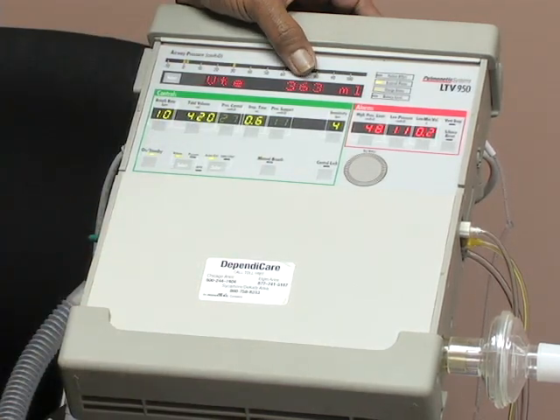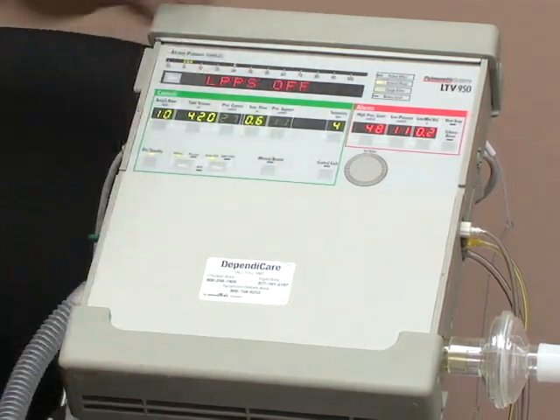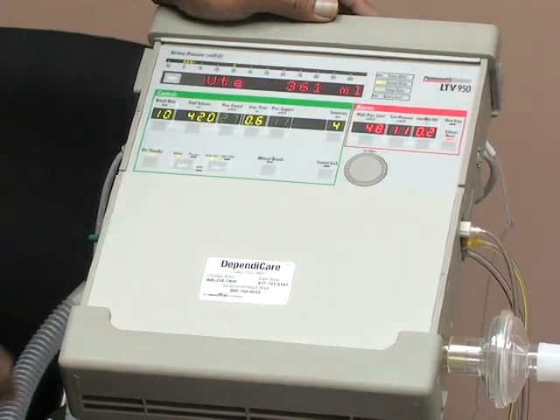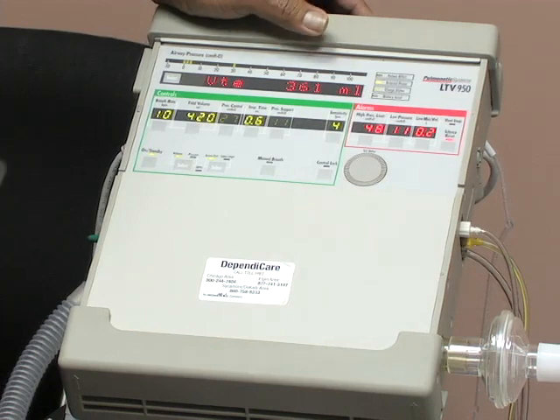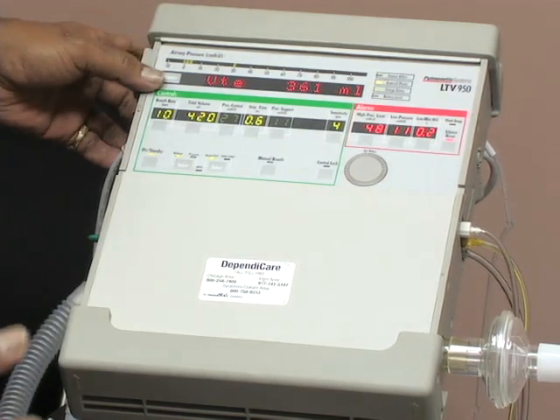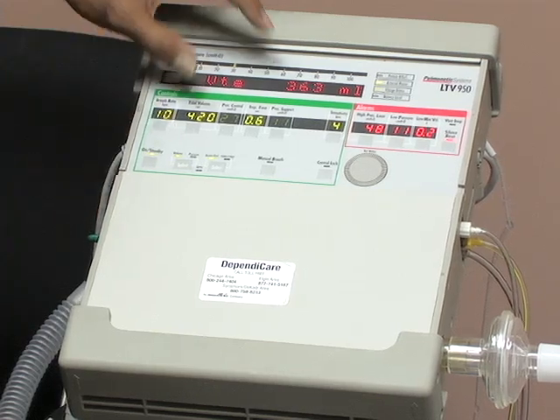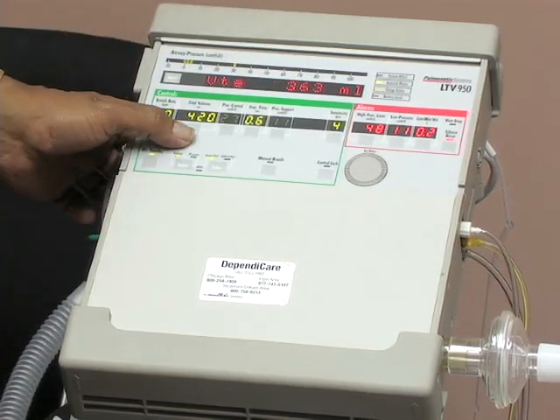And it will change. A client who is twisted, or a client who has changed his position, or a client who may give some resistance at any point in time on any breath, this will change. It's constantly changing. But it should be within close proximity.